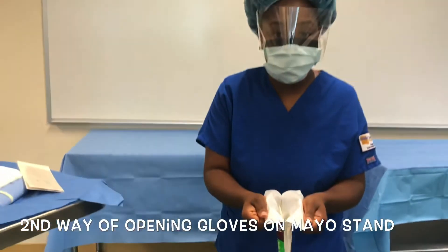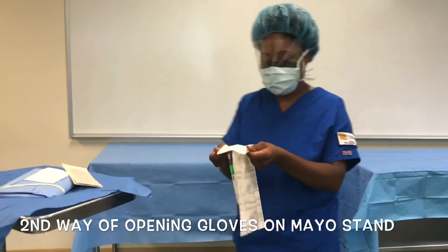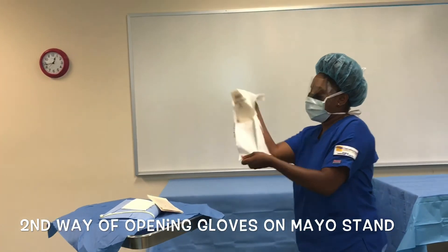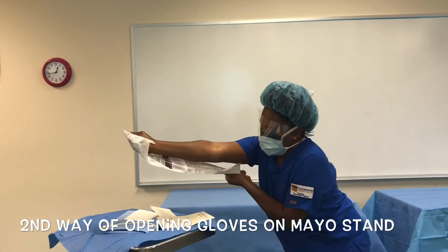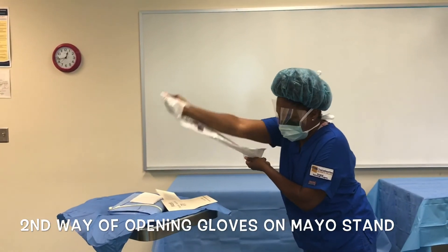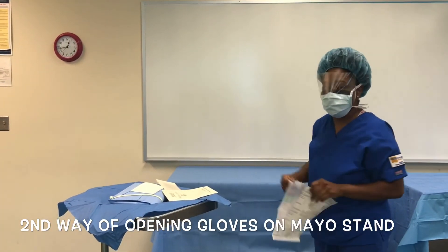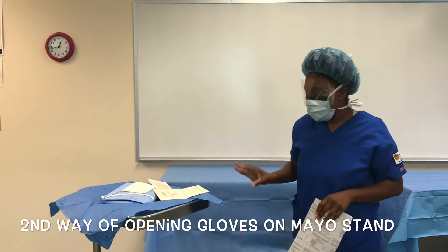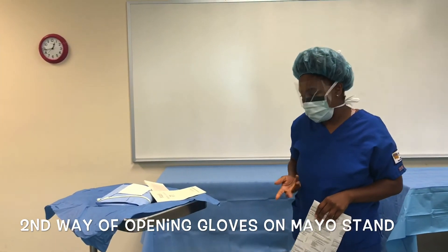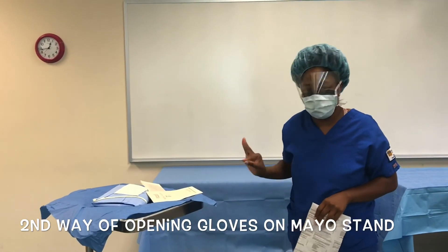I'm going to show you another way to open up your gloves over the Mayo stand. You can put it over like this and cover your arm — it kind of protects your arm from being over the sterile field. I'm still within the one inch of it, because if your stuff hits the one-inch mark it is technically contaminated, so try to stay as far as you can from that one inch.